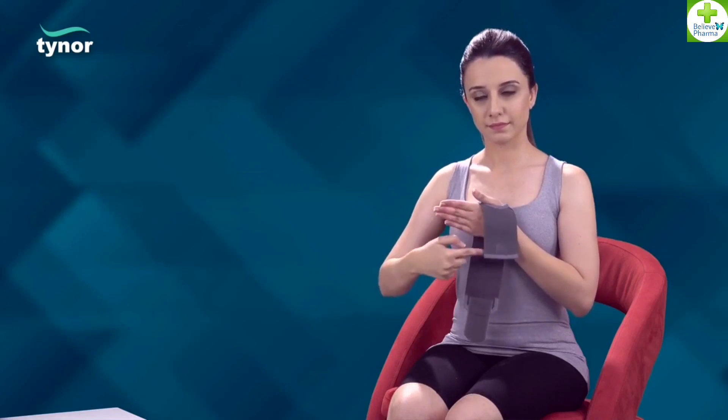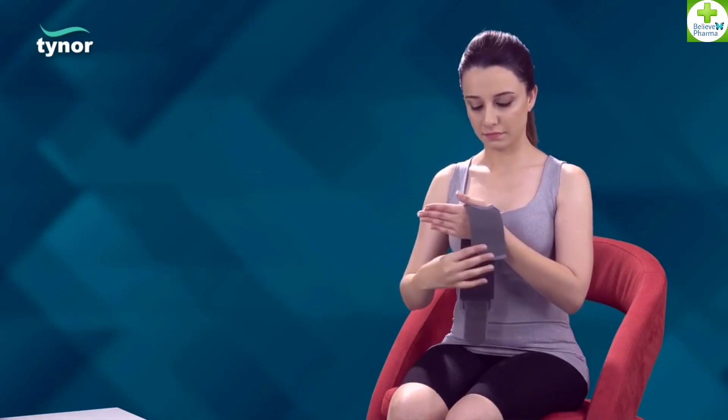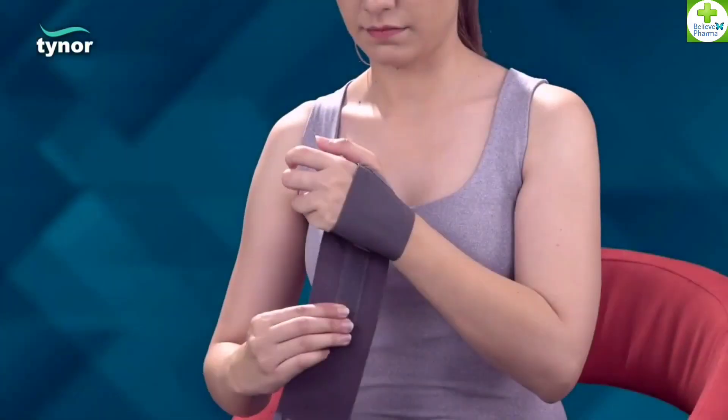The shorter end should go over the upper surface of the hand and wrap the product around the palm, then around the wrist passing over the thumb. Tighten the strap to a comfortable compression.